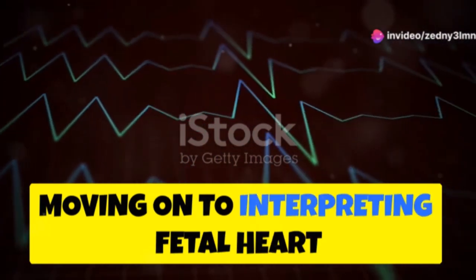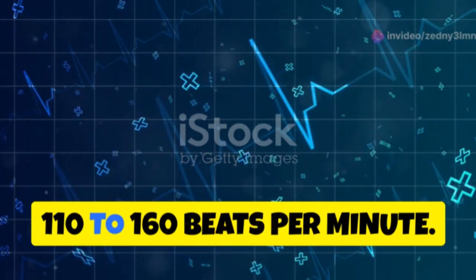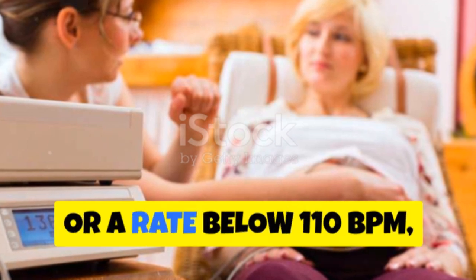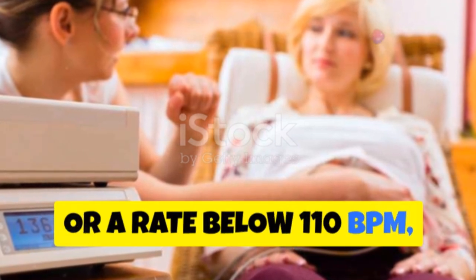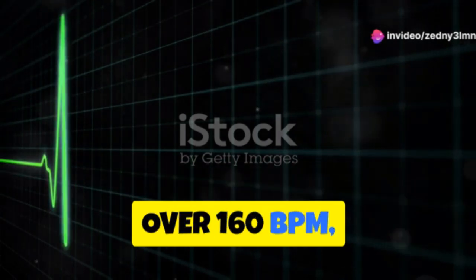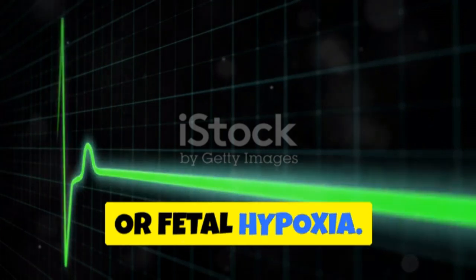Moving on to interpreting fetal heart rate patterns. A normal baseline heart rate is between 110 to 160 beats per minute. Bradycardia, or a rate below 110 bpm, might indicate fetal distress. Tachycardia, over 160 bpm, could signal maternal fever, infection, or fetal hypoxia.